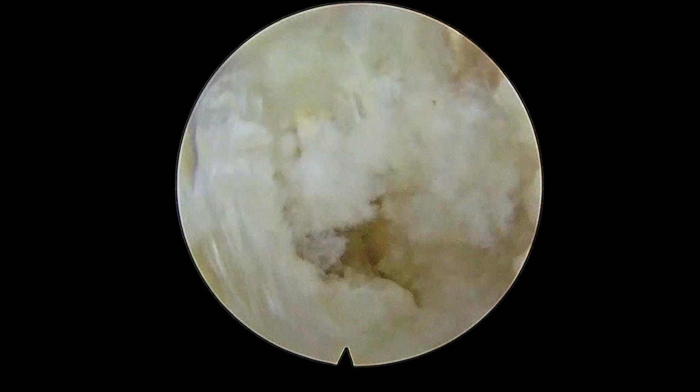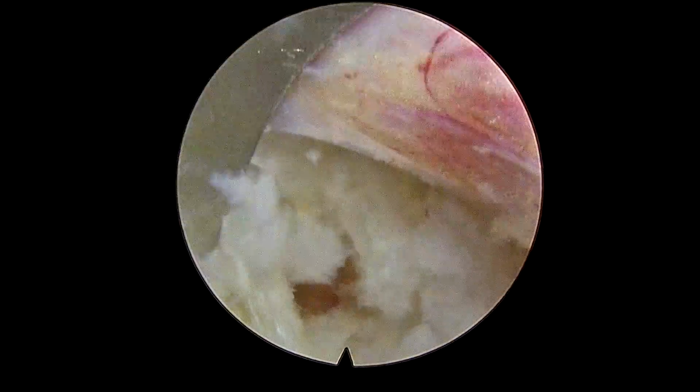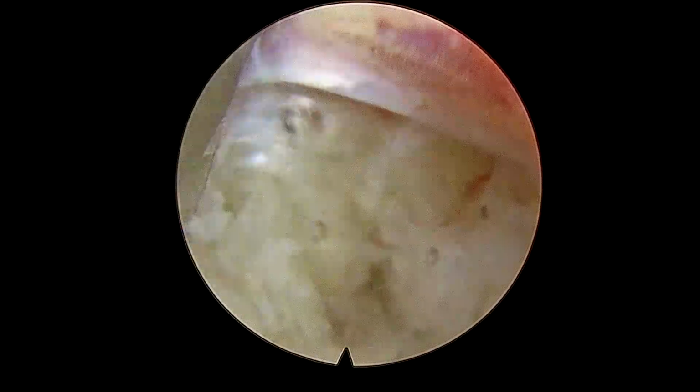Some surgeons use a curette to scrape the loose fragments from the disc, but I don't think it is necessary. I just go inside with the help of forceps and try to remove as many fragments as possible. We do not want to remove an excessive amount of the nucleus pulposus from the disc, otherwise the patient will start having a disc collapse and will develop back pain in future. So once these larger fragments stop coming from the disc space, I'll stop. But yes, in a young patient you have to spend more time removing these disc fragments from the disc space. They keep on coming.